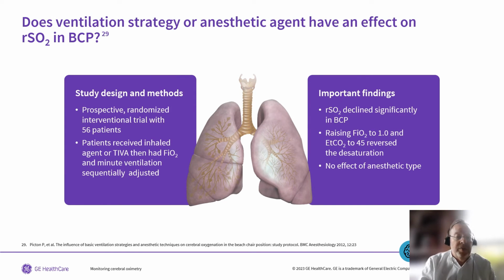Finally, here's an interesting study that talks about the effect of ventilation strategy or anesthetic agent on regional saturation in beach chair position. I think this study elegantly demonstrates the impact that these physiological variables can have. What I'll show you is that in this prospective randomized trial with 56 patients, they either received inhaled anesthetic agents or total IV anesthesia, and then had both FiO2, or fraction of inspired oxygen, and minute ventilation sequentially adjusted in these patients.